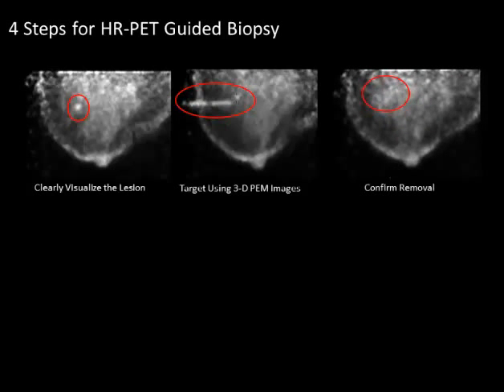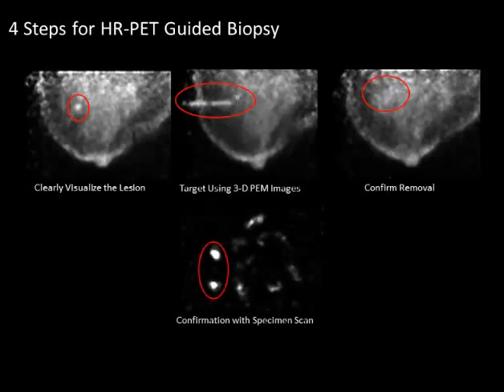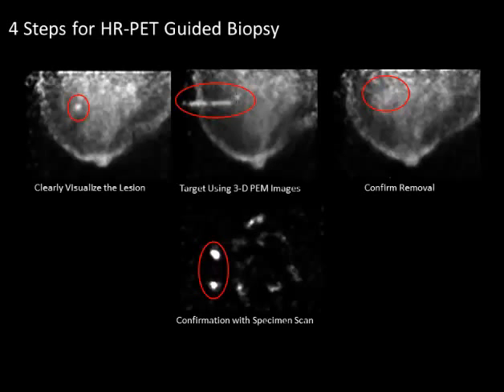and that you can then just biopsy the lesion in. After you've done your tissue sampling, we do recommend that you do a post-biopsy image. This again is a simple 1-minute scan. In this particular case, the 3 millimeter lesion was actually totally removed with 3 biopsy cores. You're also doing selected sampling. And then we do recommend, before you release the patient, that you actually image the cores themselves. So you targeted a hot spot, you looked, did I really do adequate sampling of that hot spot? And then you check your cores.